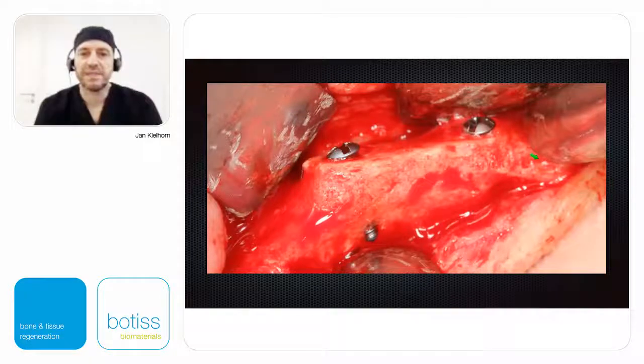Here again, you see a very nice picture of how it looks. How nicely the bone heals. So you get really the bone you build up. It's looking great. See, you can't really see where it ends and where the blade starts. So that's a very, very nice result.